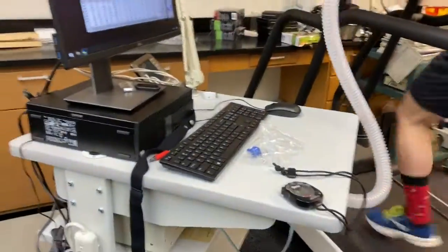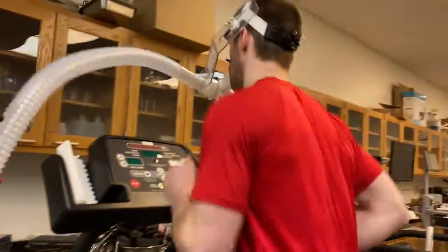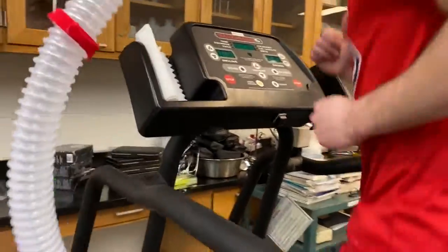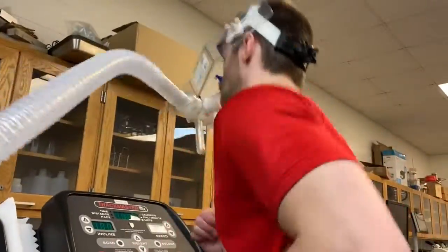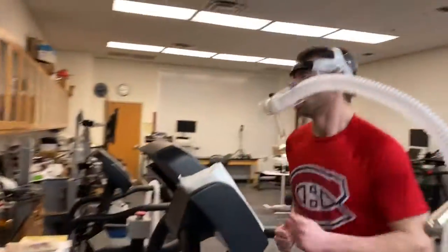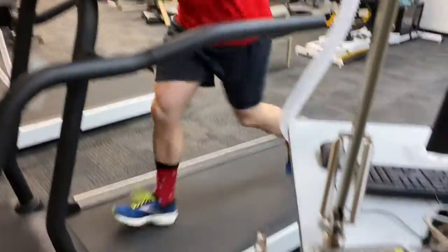Right here is Michael, he's running on a treadmill. We have everything hooked up right there. You can see on that computer — that's where all of the data is actually going to be acquired, and we'll take down data every minute effectively, so it'll be pretty easy to graph.